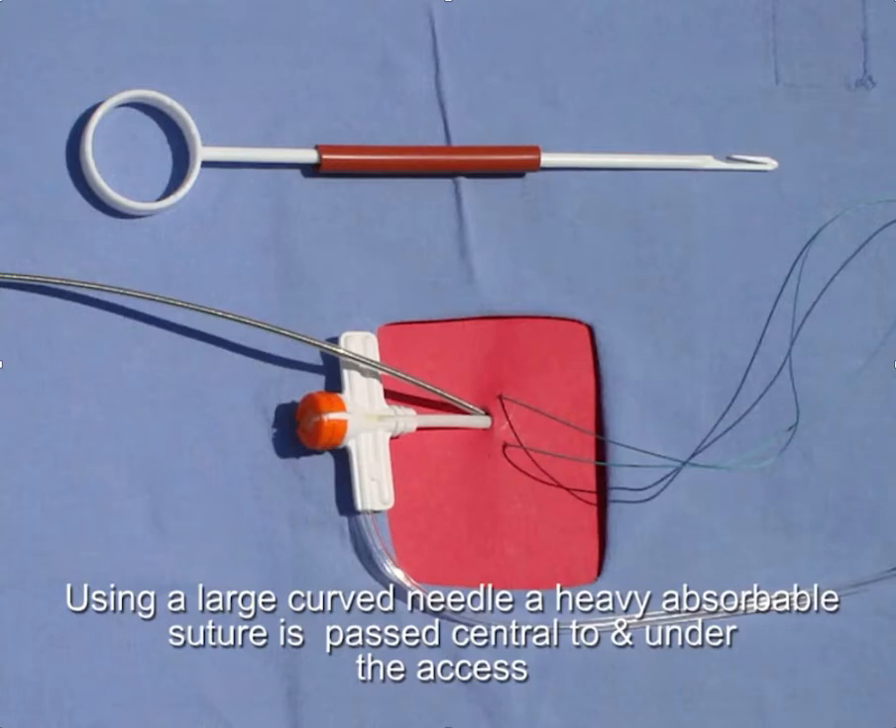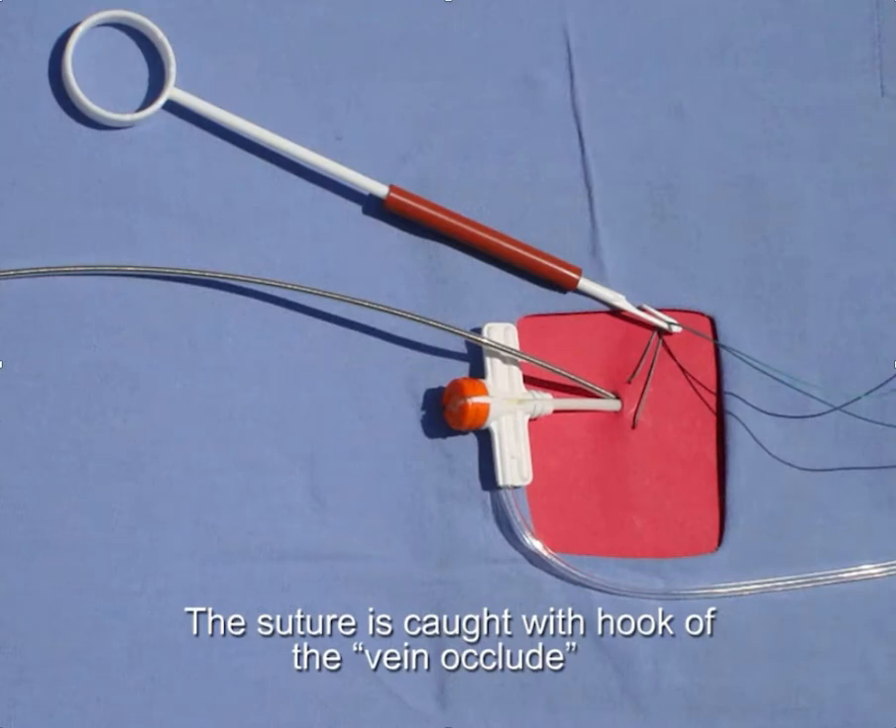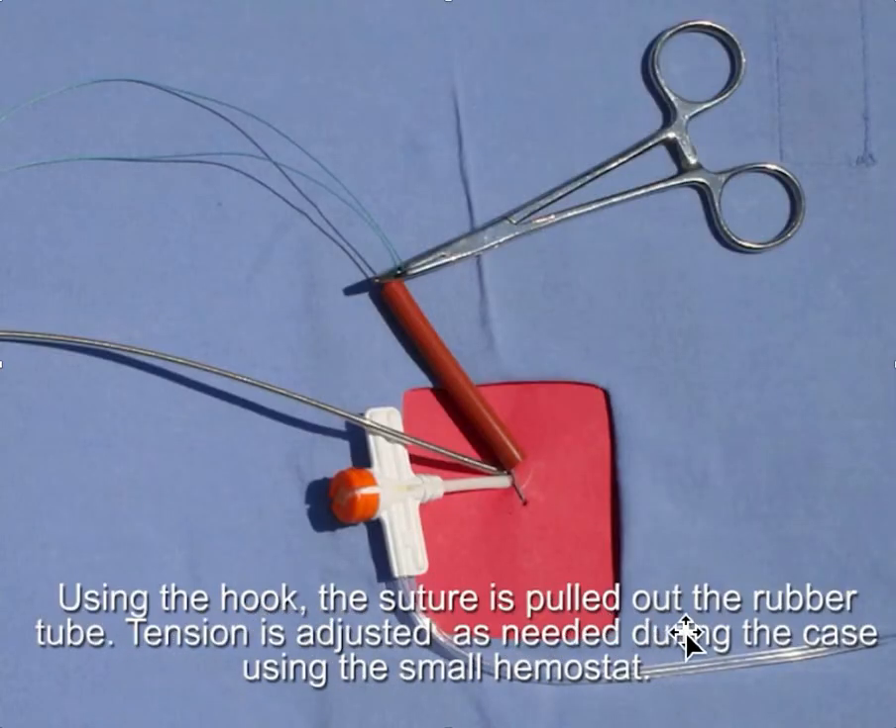Once you get the suture underneath — and it's very important that this suture passes underneath where the leads are, deep to it — then you catch the suture with this little fish hook and pull the suture up. The suture is pulled out of the rubber tubing, and then you can adjust tension as needed during the case using a small hemostat. If you need more occlusion, you just pull tighter on the absorbable suture and then put the hemostat down tight against the entry point.